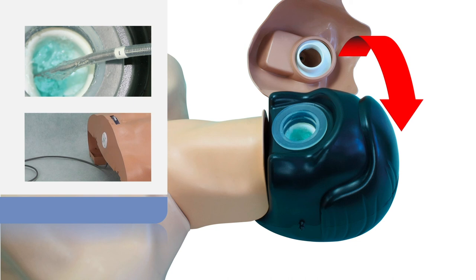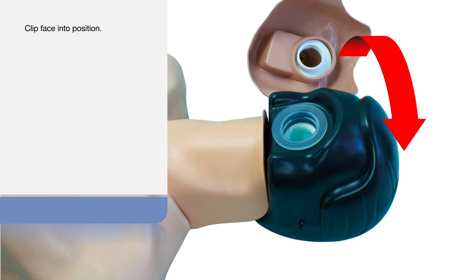The probe can now be removed and wiped clean. The face can now be clipped back into position.